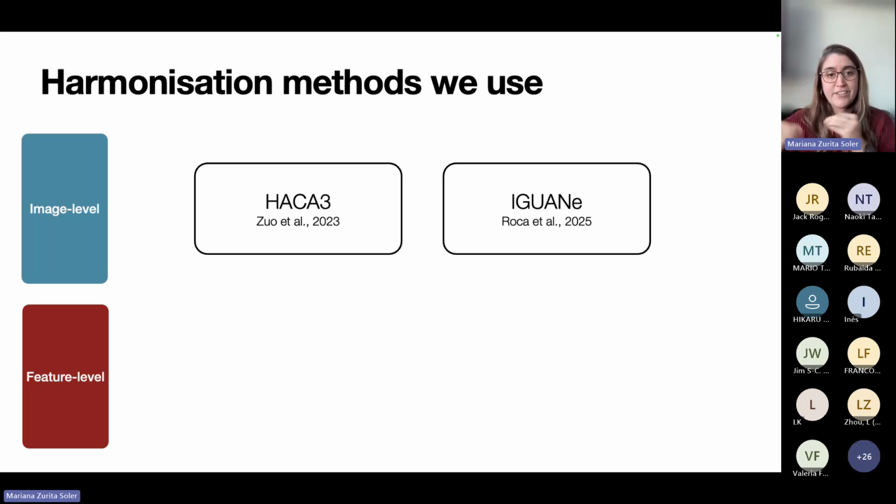Within this generative network, they train on a data set using a lot of different images from different sites, and images scanned in the same one. Then within each slice, they can look at the differences and separate the biological from the contrast. That's the benefit of image level harmonization: whenever you're controlling and harmonizing everything, you can separate the contrast from what is biologically actually there.